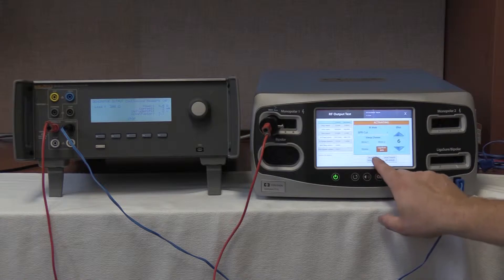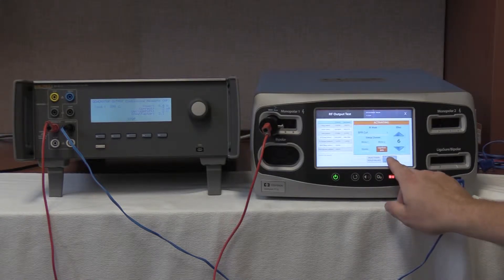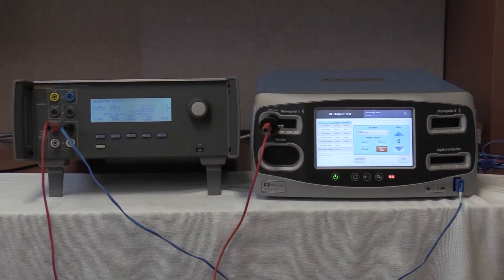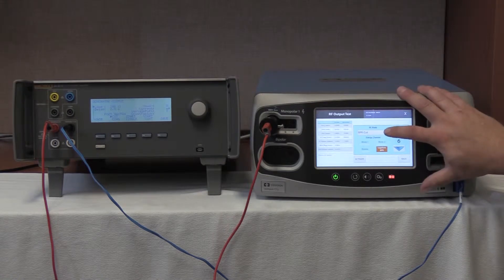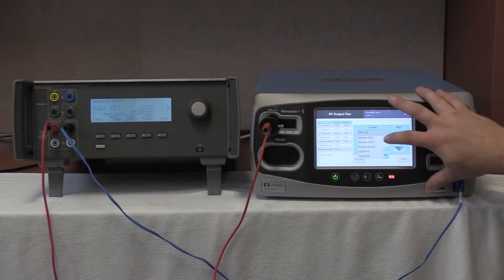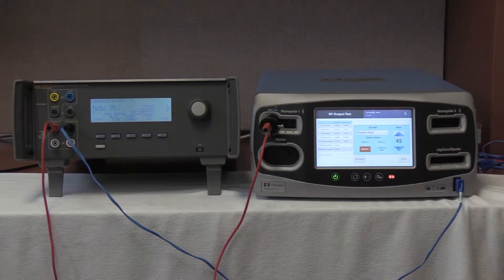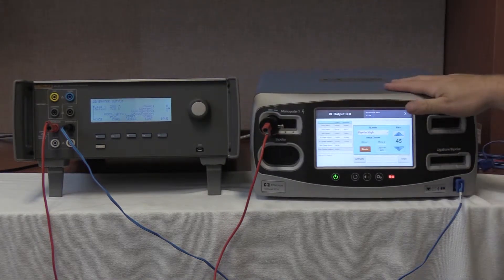Deactivate and hold values. We are now going to deactivate and stop on the QES-3. We are now going to select bipolar high. Go to RF mode, bipolar high. It is important to note that both of these units are not touching each other and are on non-conductive surfaces.